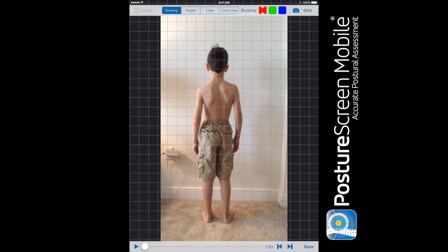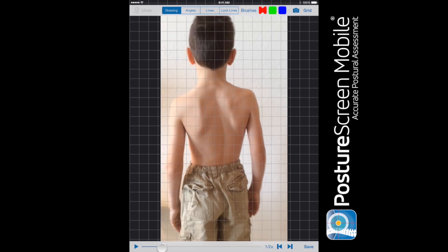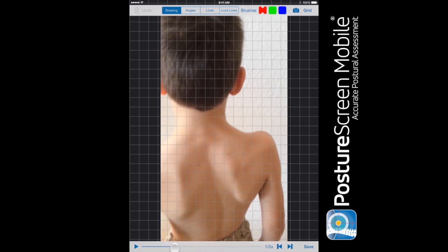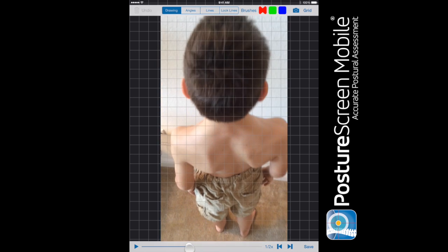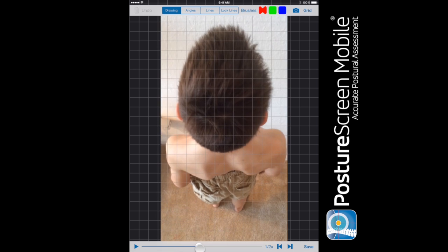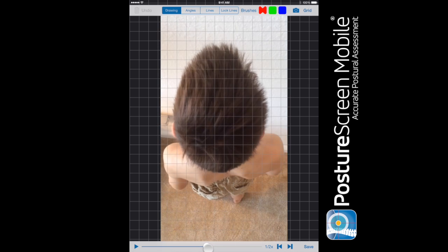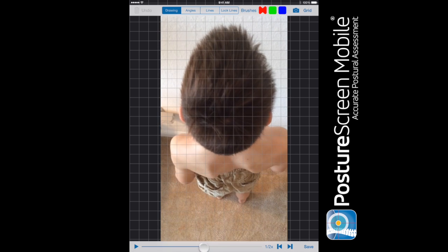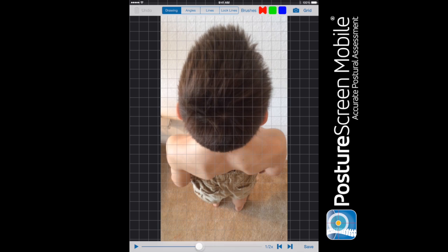So what we want to do is we want to walk up on the patient, and if this is an adult we may have to use a chair. But what we need to do is we need to be able to see above down and be able to see the feet as well.